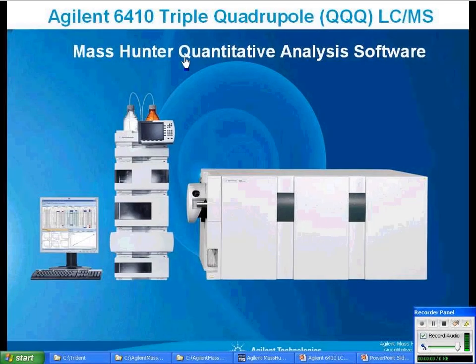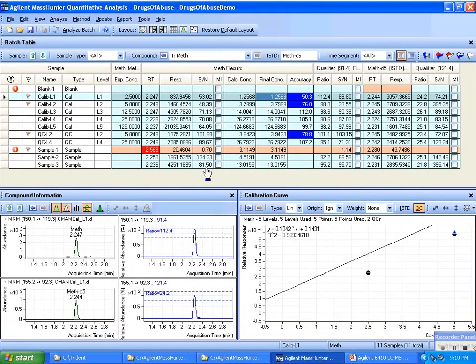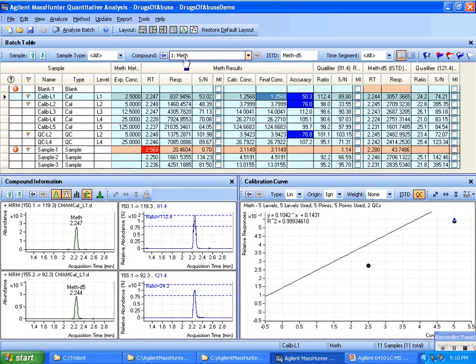Let me discuss a tool that's quite useful in managing your calibration curve. So let's go to the application. And here I see I've got the drugs of abuse, and for methamphetamine, I've got a problem at several levels here. The outliers warn me the accuracy at several calibration levels is poor, along with the QC.